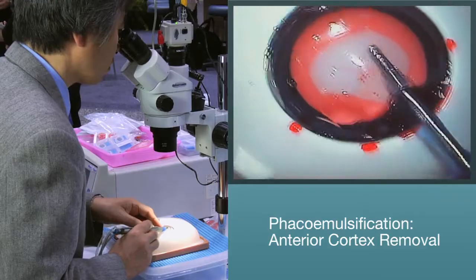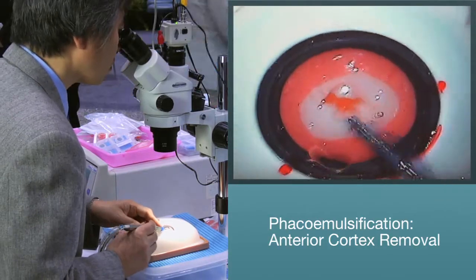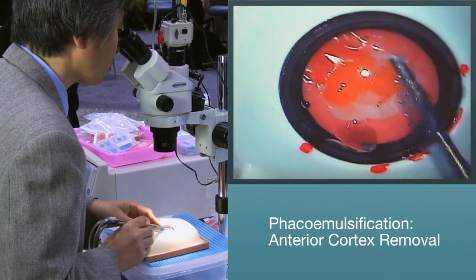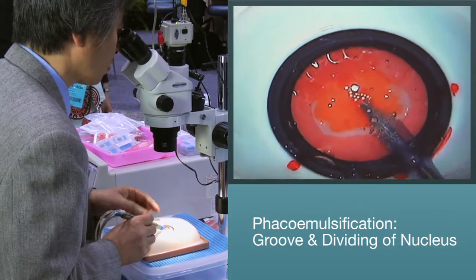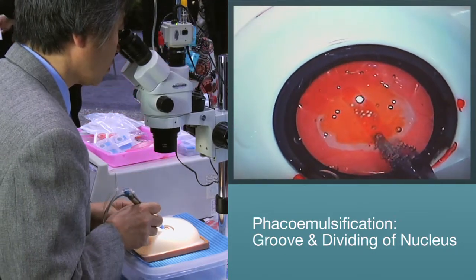Anterior cortex removal. Once in the eye with the phaco handpiece, the surgeon makes a few passes with the phaco tip to remove or initiate the debulking of the anterior cortex. Once the anterior cortex is removed, you can begin to make your grooves with the Kataro manipulator chopper to begin to divide or chop the nucleus.